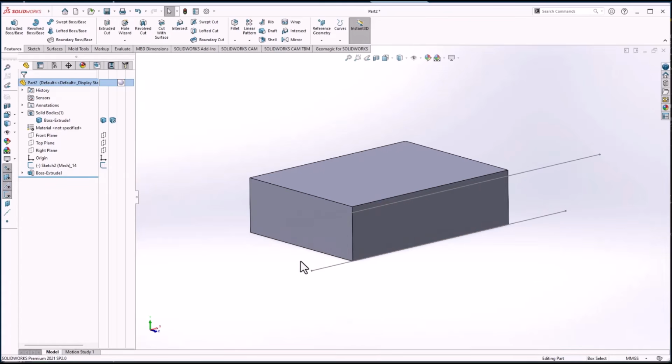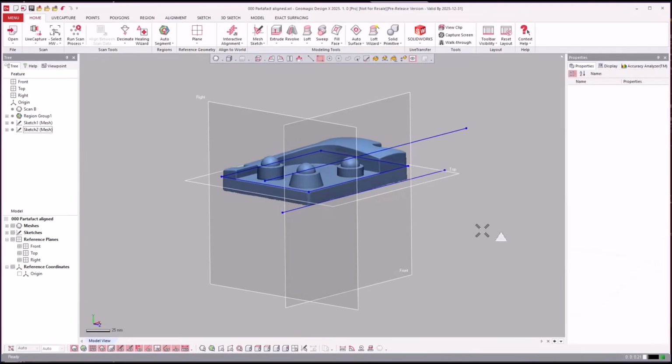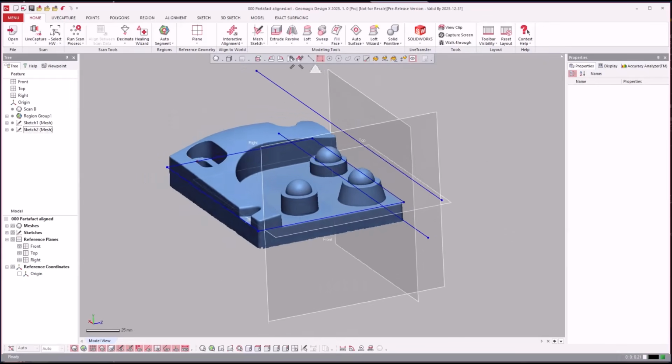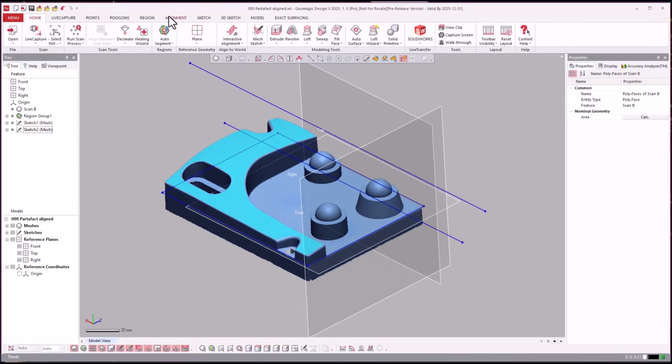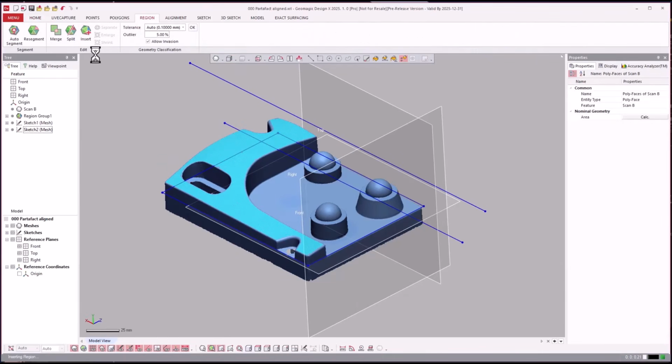And so what I did is I just cut some sketches. I hit send over. And then now I can just toggle back over here and say, you know, this top surface, let's go ahead and create a region out of that.